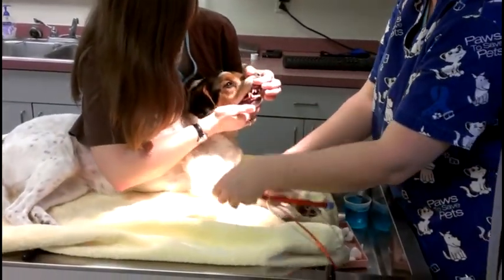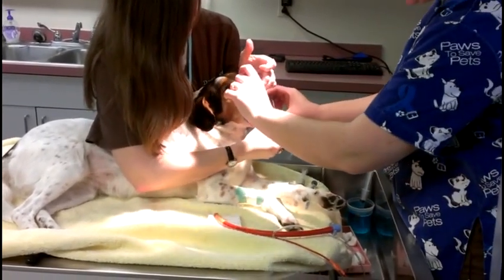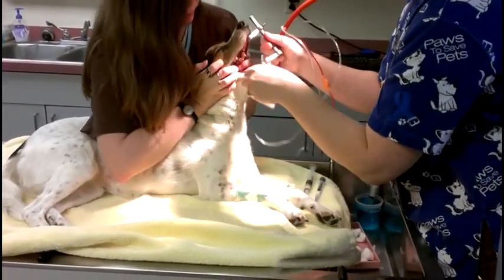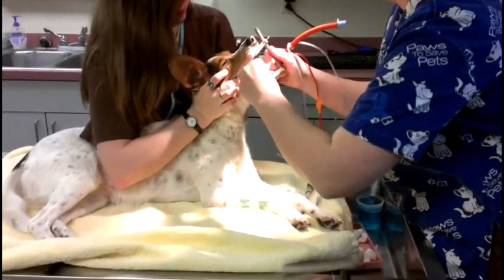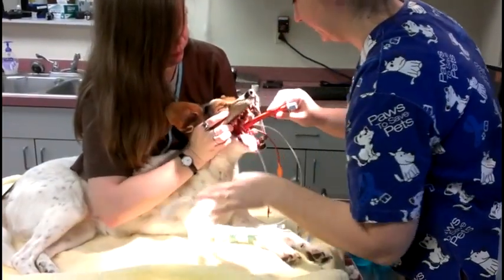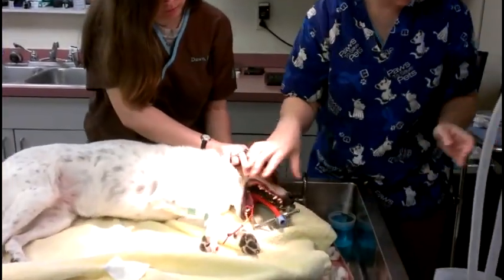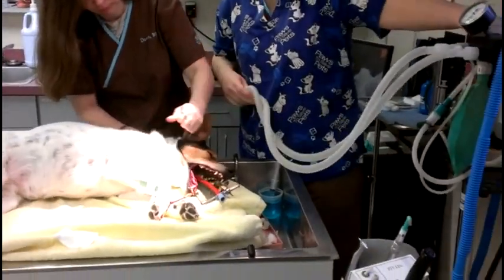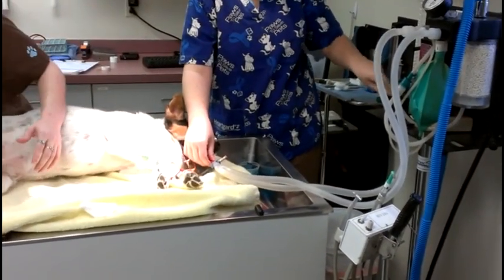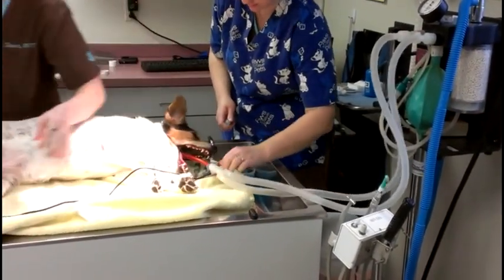Once she's sleepy, the next thing we're going to do is put in a breathing tube, and that's going to give her oxygen and gas anesthesia to keep her sleeping during her procedure. Mabel's going to be breathing gas anesthesia and oxygen.